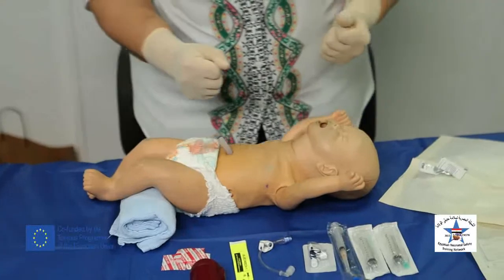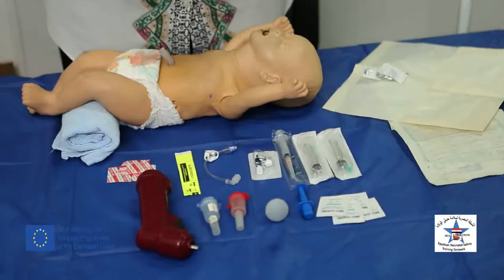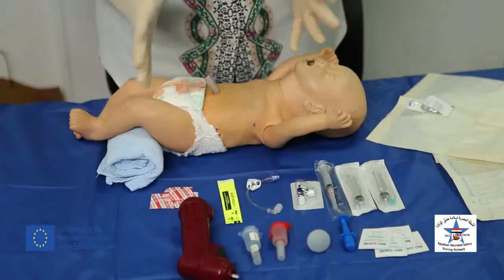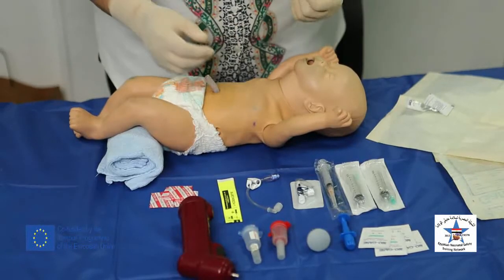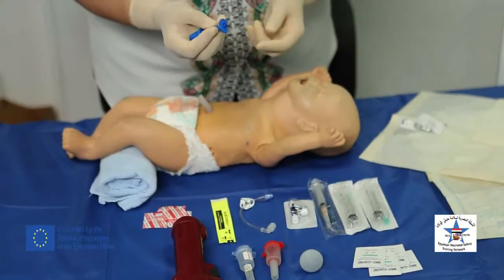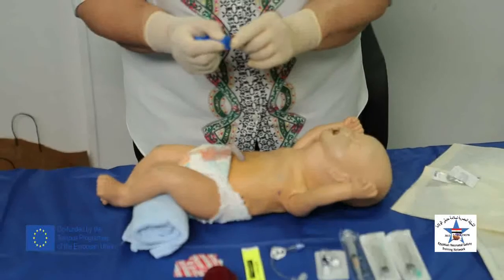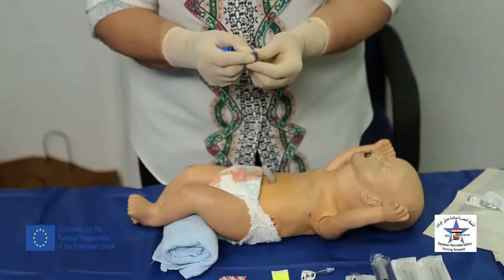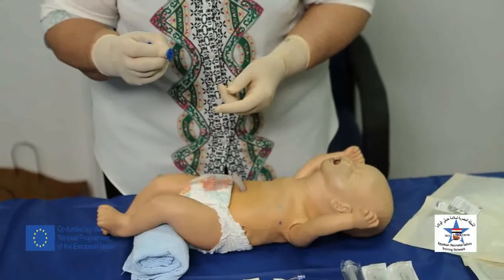And then after choosing the proper size needle, we have 2 techniques, or 2 ways, to perform intraosseous insertion. We have the manual way and the battery-operated drill way. For the manual way, choose the proper size of the needle. The needles have sharp beveled ends with trocar and cannula. Put the base of the needle in the palm of the hand, supporting it properly with the index finger and thumb.